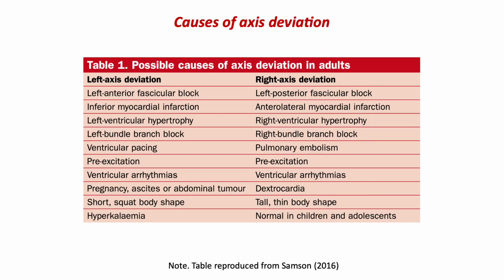Here's a list of the common causes of left and right axis deviation. I'm not about to go through the pathophys of each one, but you can certainly hit me up if there's anything that you want explained a little more. Chances are that I won't know the answer, but I'll try and find out for you.